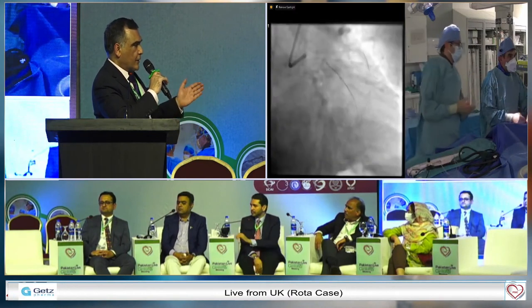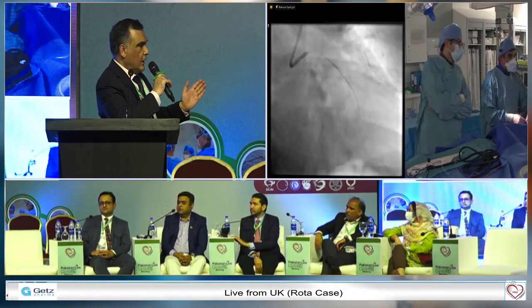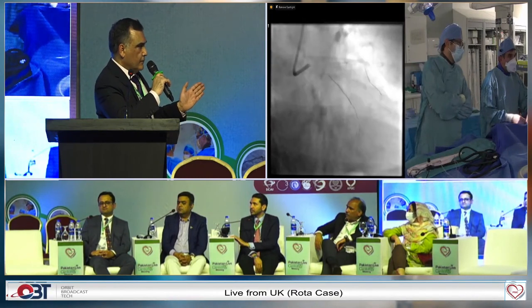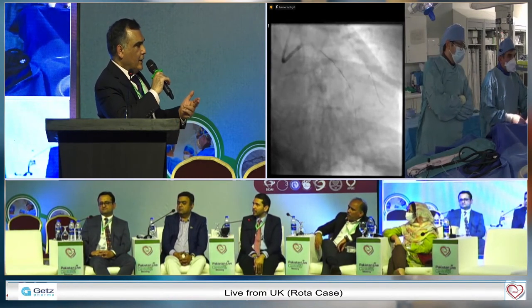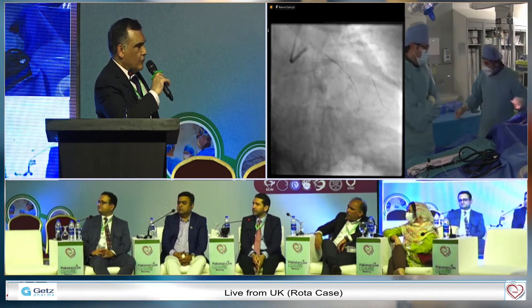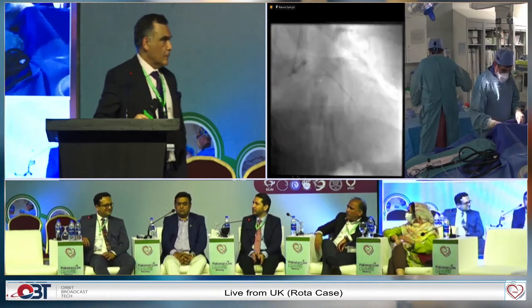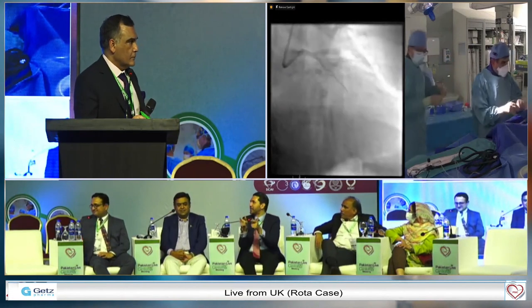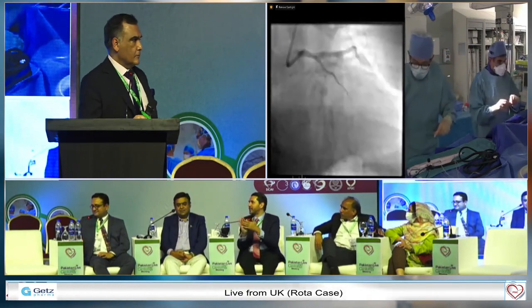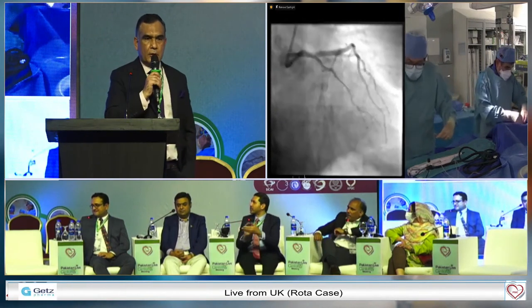And if it does, if a calcium plaque ruptures and goes and occludes a large side branch, then you've had it. Because now you've got to go in an angled way into a calcium plaque and an ostium of a side branch. I'm not sure if the differential cutting concept applies to a hard surface wire. It's smooth though, but it's still uneven with the vessel wall. You could still shave off some of the vessel wall and material. Then okay, Mohaned, thank you very much.